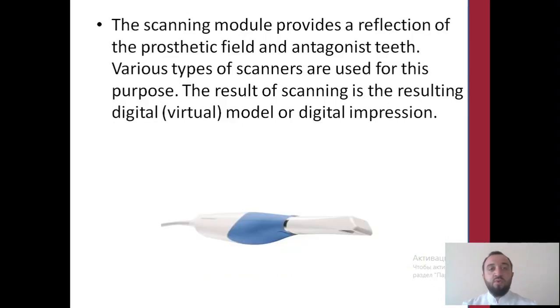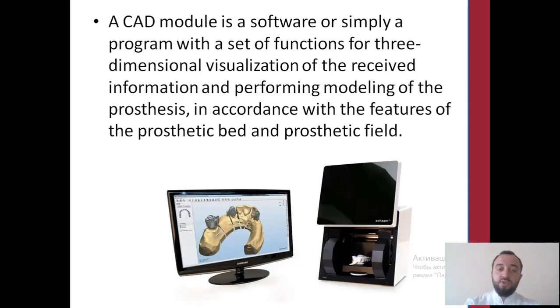The scanning module provides a reflection of the prosthetic field and antagonist jaw. Various types of scanners are used for this purpose. The result of scanning is the resulting digital model, the digital impression.